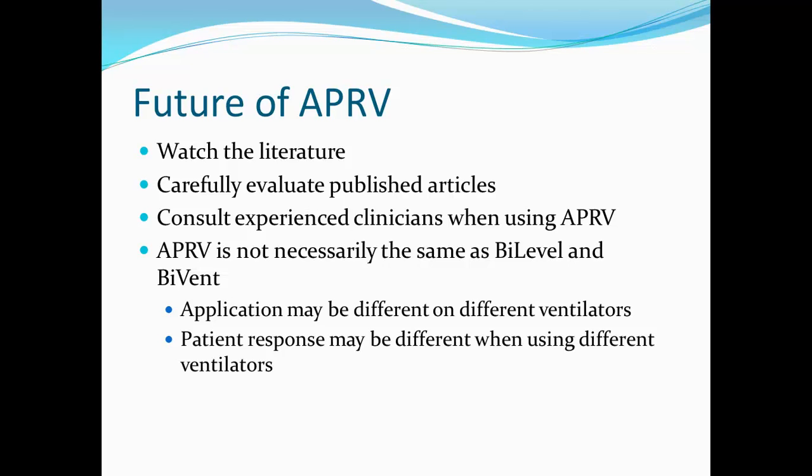One other concept or fact that I think we need to be a little bit careful of is, even though most all ventilators do volume AC or pressure AC fairly similarly, I think that ventilators that have APRV versus bilevel versus bivent do each of these rather differently.